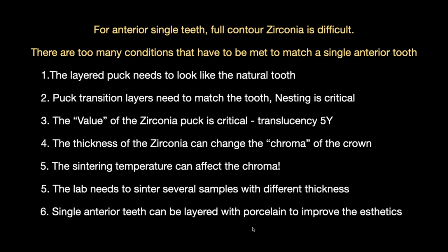I have no idea what it's supposed to look like. And you can talk all day about perfect firing temperatures and all this stuff, but I've seen too many different situations, different looks with the same zirconia fired in different furnaces. So you have to learn your material. You have to do some homework. On some of these zirconia crowns, I have some that are 0.5 millimeter, some are 0.7, some are 1, 1.2, stuff like that.